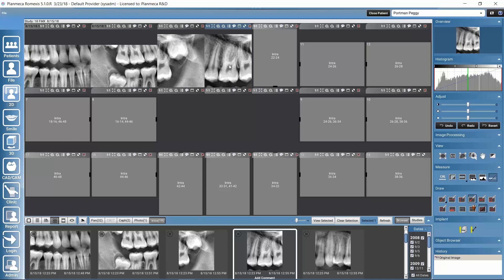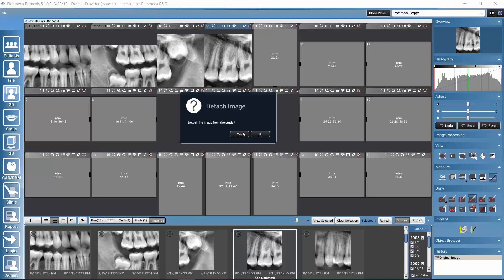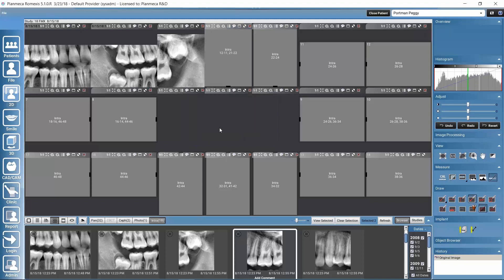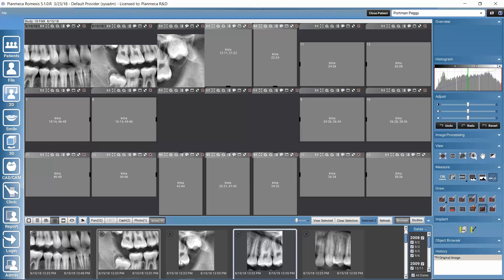If we notice there are images we didn't want to include, we can remove an image from the study layout by dragging it outside of the viewing area. Romexis will ask for confirmation whether we really want to detach the image. Removing it from the study does not delete it from Romexis — we can still find it in the image browser for the patient.